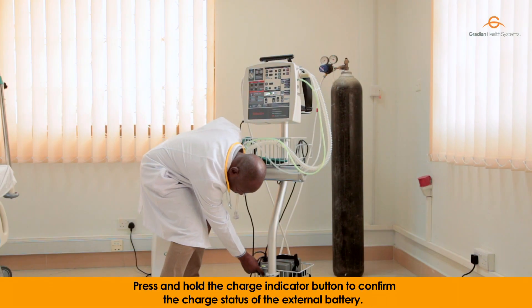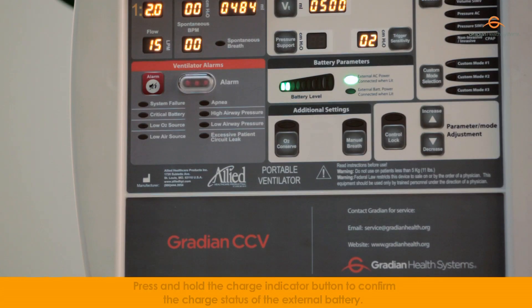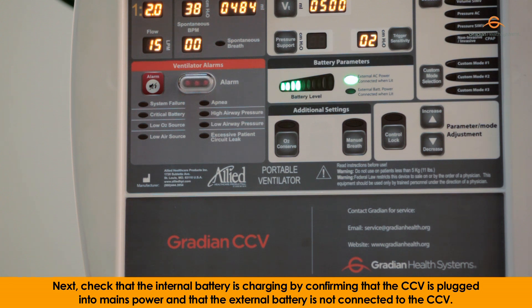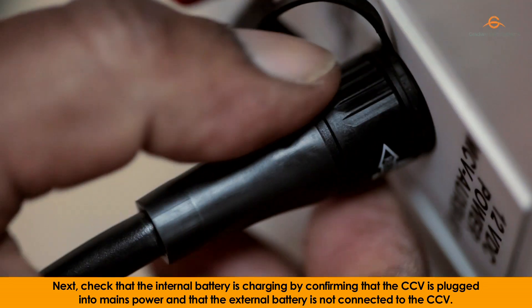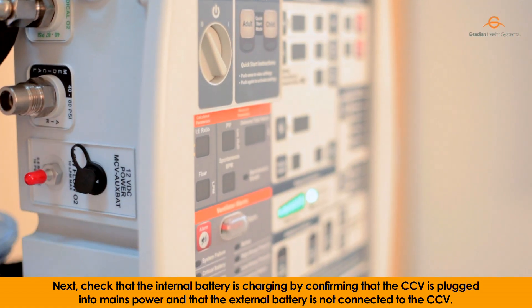Press and hold the charge indicator button to confirm the charge status of the external battery. Next, check that the internal battery is charging by confirming that the CCV is plugged into mains power and that the external battery is not connected to the CCV.